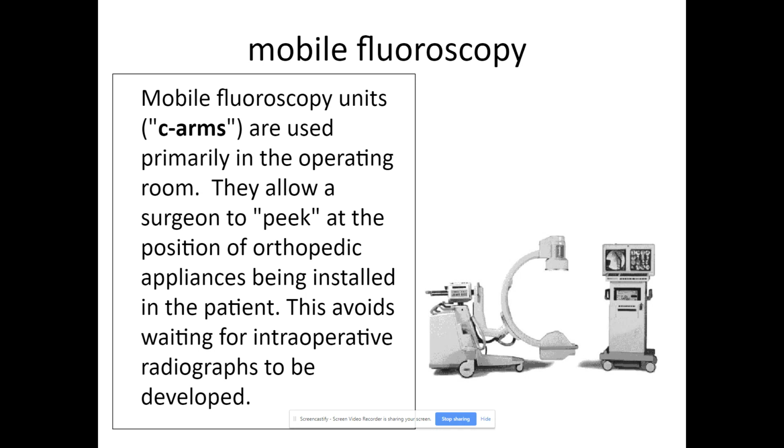But these units are great because they move, and there's an art to that. If you watch some of the videos, that's the one piece of equipment we don't have. We have an MR and a CT, but we don't have a C-arm. Those things are really good. The wheels can turn, so you can go back and forth. It's associated with monitors that usually have a last image hold function. So you'll have an image here, and the next time you fluoro, it'll move to the right and stay there, and then get replaced every time you do something.